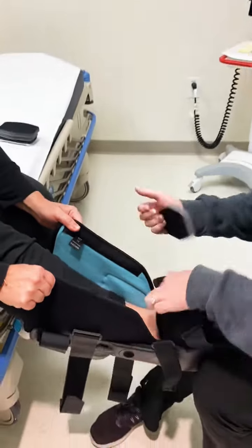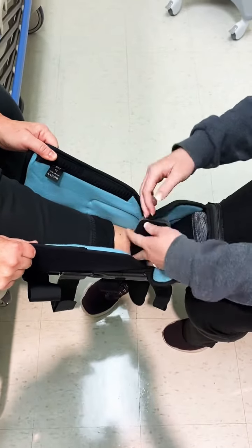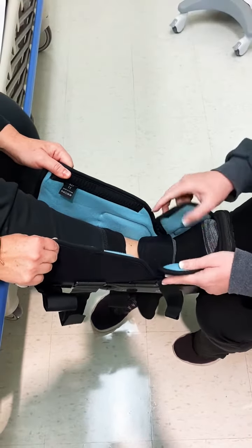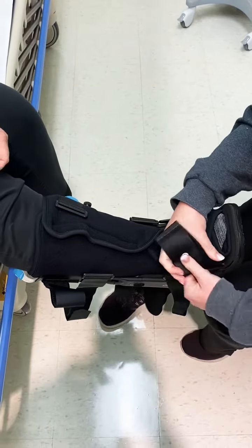Once you have the foot in there, you're going to take this piece — I like to tell people it's kind of like the tongue of your sneaker — put it in there for extra padding. There'll be spare pieces that you can give the patient.